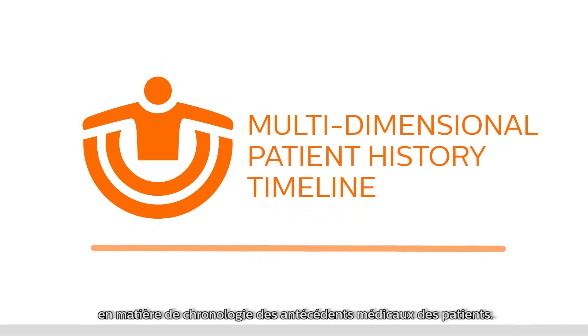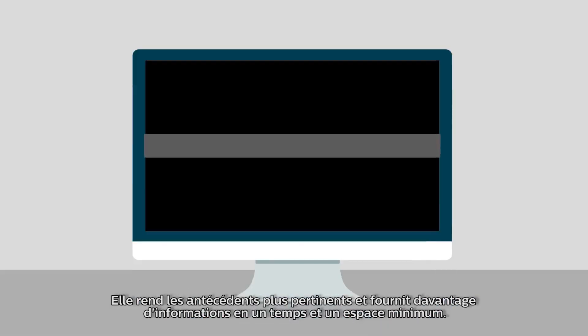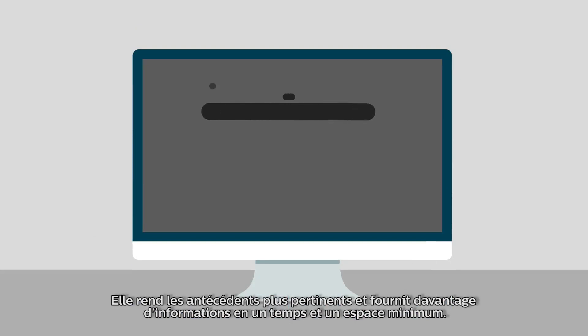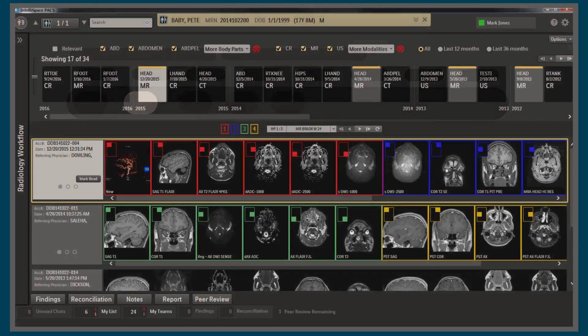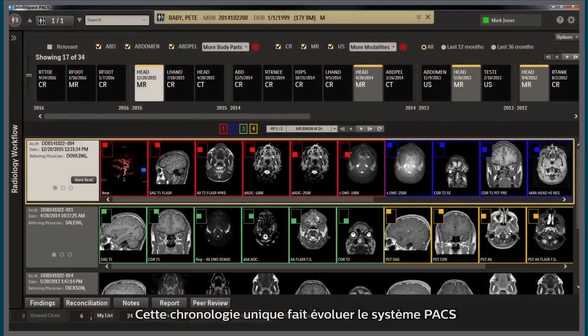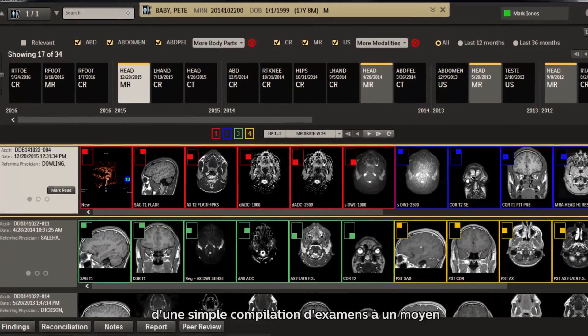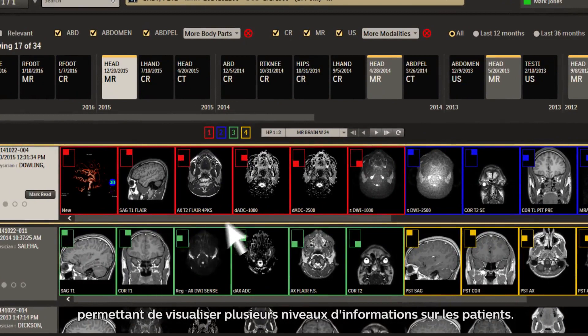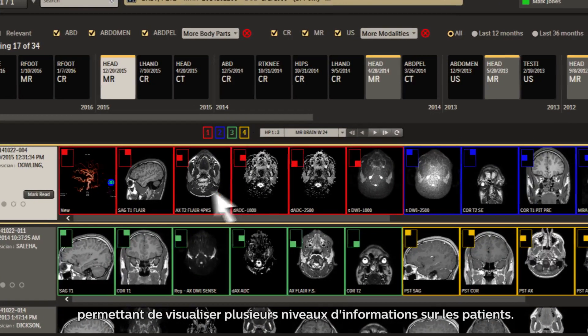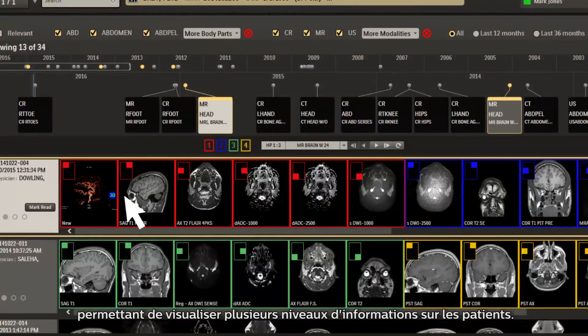The multi-dimensional patient history timeline adds a new dimension to the concept of patient timelines, helping it become more meaningful and capable of delivering more information in the least amount of time and space. The unique timeline transforms Pax from a collection of discrete studies to a vehicle for insight into multiple levels of patient information.